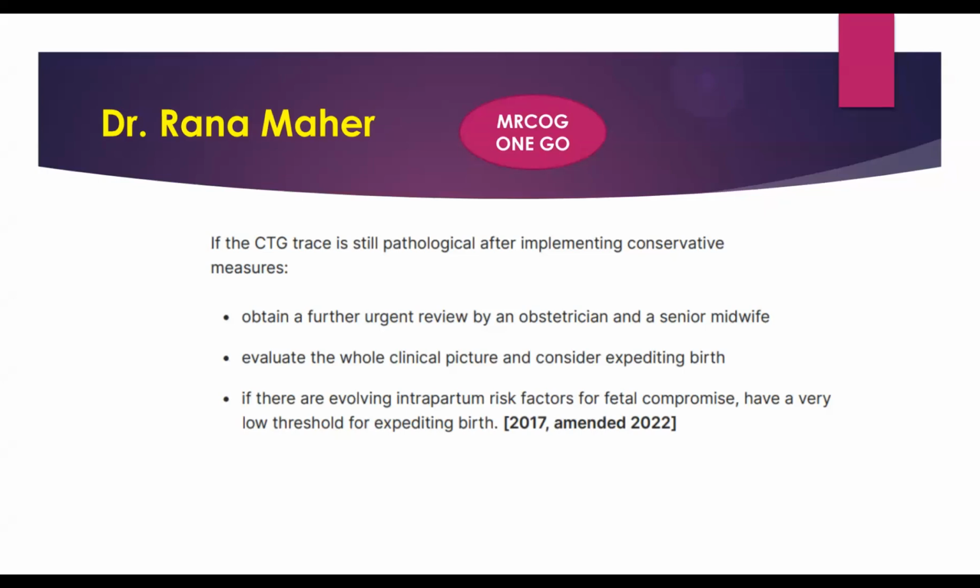If the CTG is still pathological after implementing conservative measures, we need a further urgent review. We will evaluate the whole clinical picture. It's in all guidelines, RT. It's not here specifically, but we need to offer this woman fetal blood sampling, or the baby fetal blood sampling. Okay, evaluate the whole clinical picture, and we want to see if there are any intrapartum risk factors for fetal compromise.